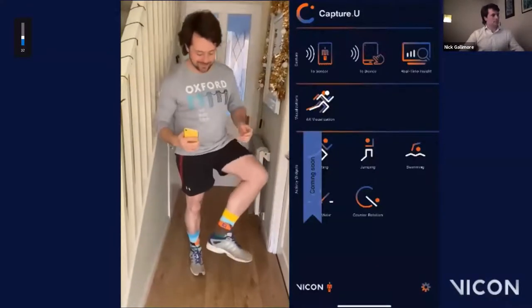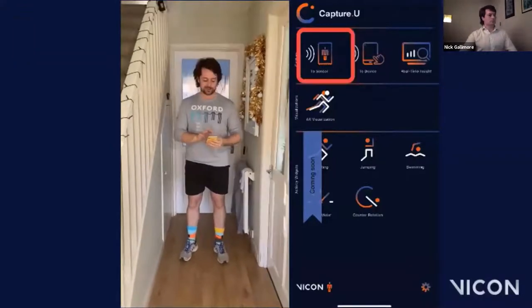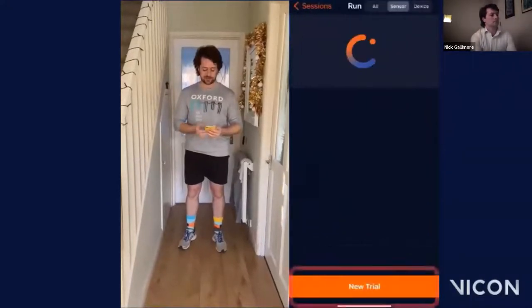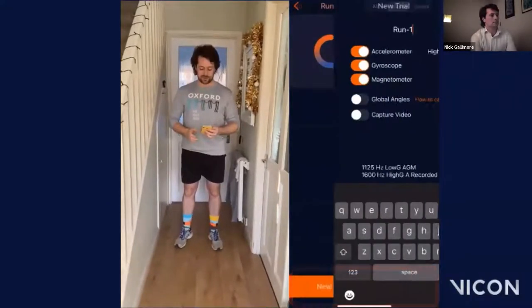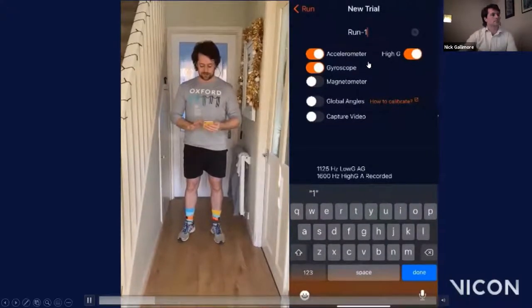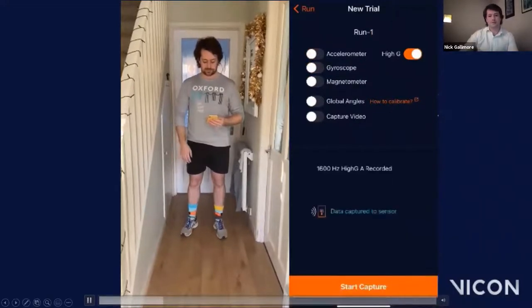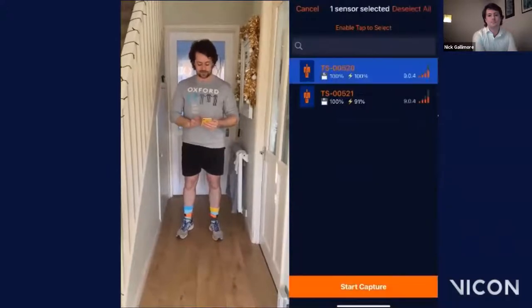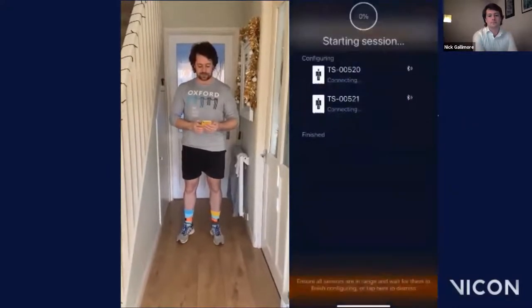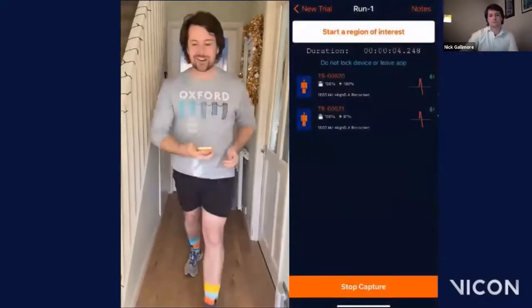Here's a video showing how to put this into practice using the app to capture data. This is where you can select your sensors. To start a session, go to the CaptureU app, click Capture to Sensor, and within the new session, select the new trial. I'm particularly interested in the high-G data, so I'm just going to disable the other components.